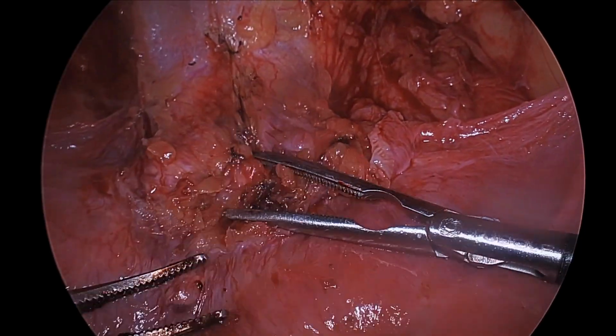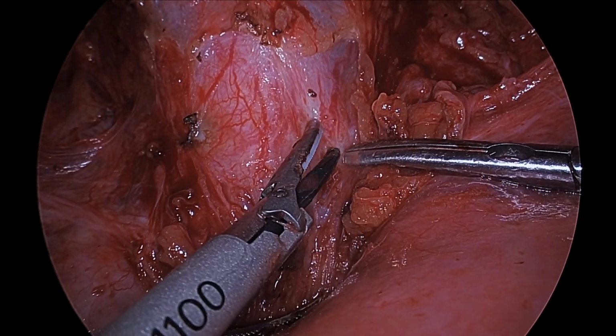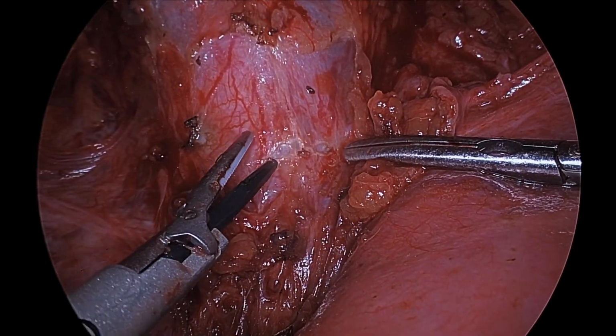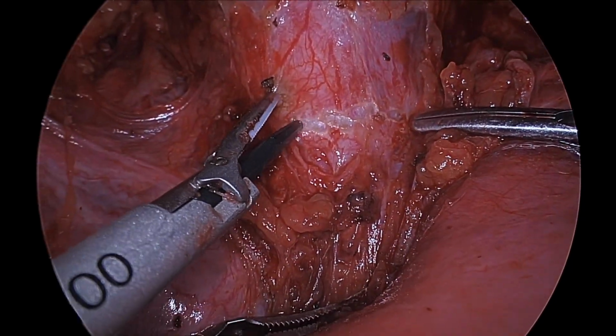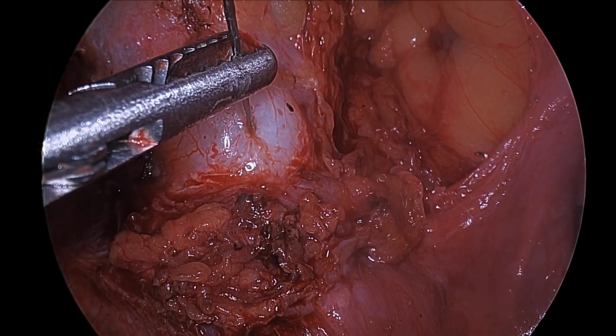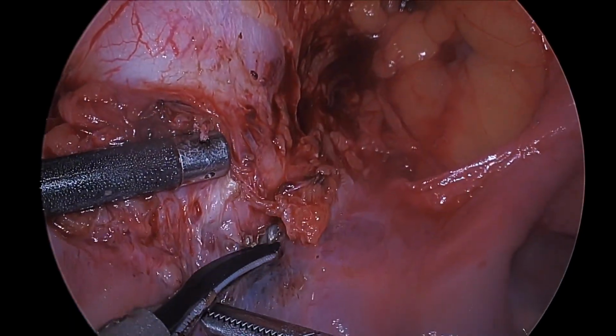With the bladder peritoneum dissected, the bulge is even more obvious. The boundaries of the pregnancy are demarcated with an ultrasonic device prior to any distortion of the anatomy. The outer edges of the pregnancy are then infiltrated with vasopressin via a spinal needle transabdominally. The dissection of the cesarean scar ectopic pregnancy was then initiated.